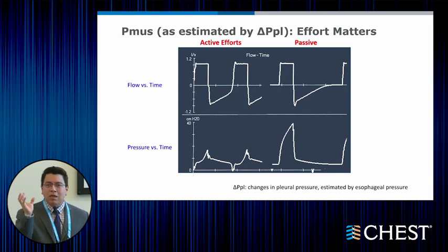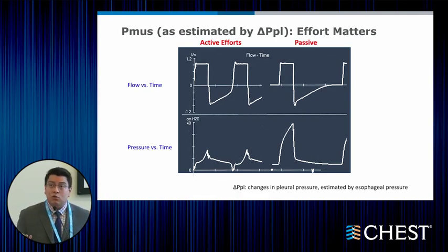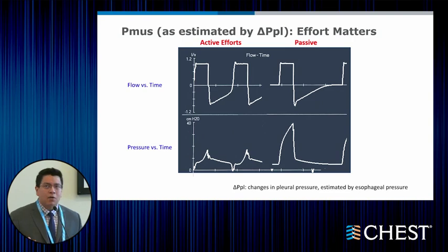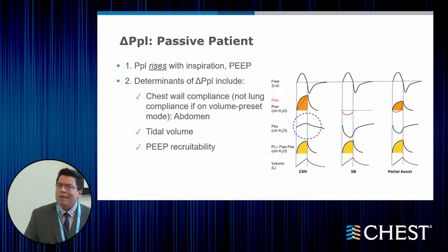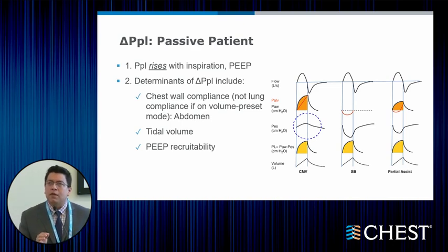So the only pressure that is acting on that total pressure is the ventilator pressure, which is a positive pressure, and the total pressure is going to be higher, all right? So we have another representation here, and this is the principle for any type of patient-ventilator desynchrony and evaluating the comfort of the patient.